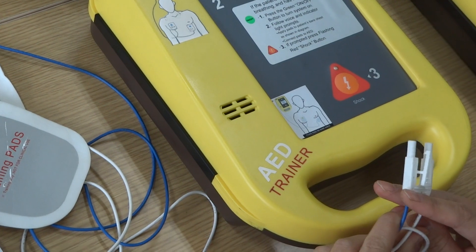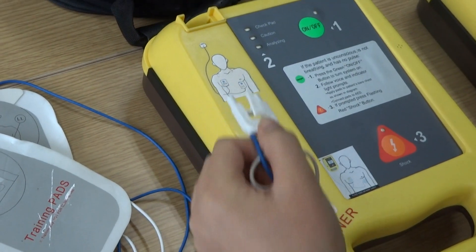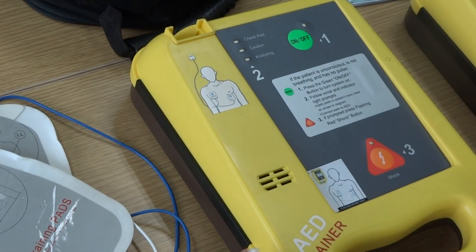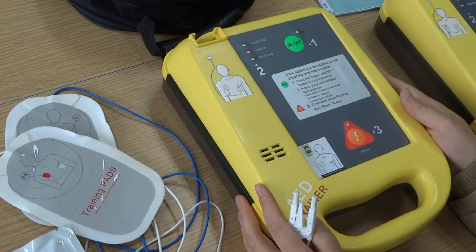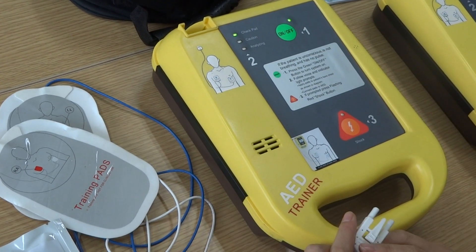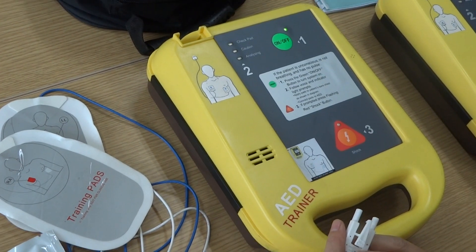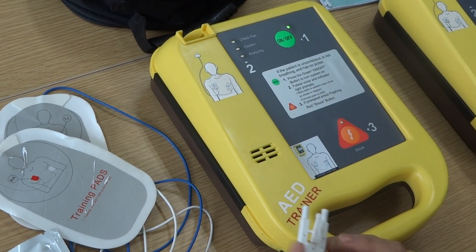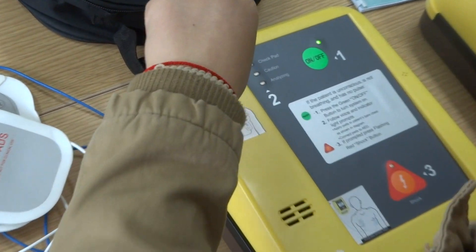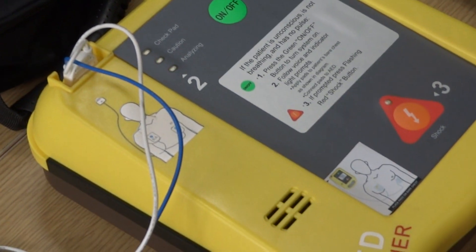As all operations will have a voice prompt, the emergency staff must follow the voice prompts. For example, if we do not connect the pads to the device, it will prompt 'check the electrodes.' Let's try it — press the green button for two to three seconds to turn it on. It will analyze automatically. Because we have not connected the pads, it prompts to check the electrodes. Now connect the pads — just push in. Analyzing... analyzing... do not touch the patient.